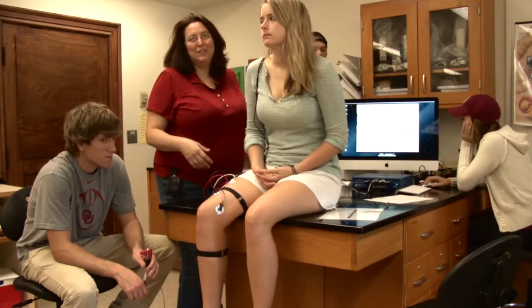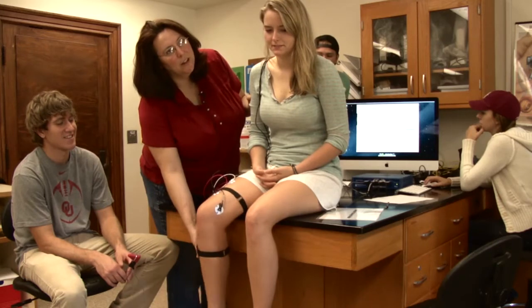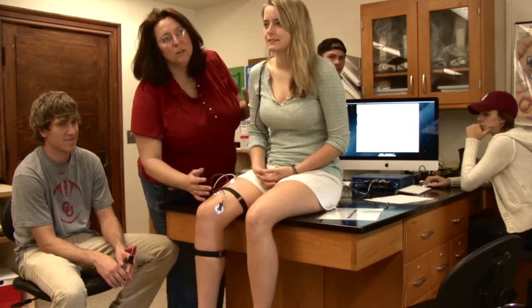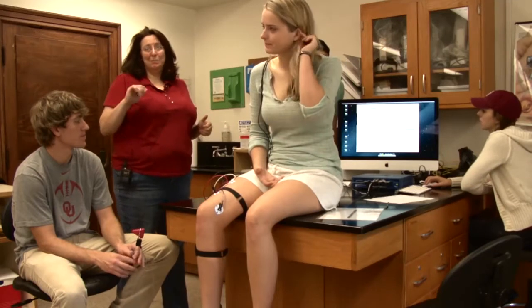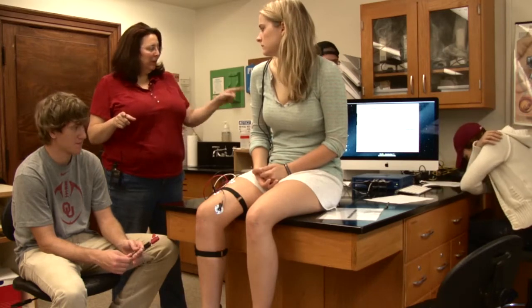If you see two EMG peaks, coach them: tell them to relax. Sometimes just walking up and saying 'let me see your leg' helps — see, she's tense. I should be able to swing your leg pretty easily. She was not even aware that she was contracting the muscle. So: two EMGs — bad; noise — bad; more than one hammer strike before the goniometer returns — bad.